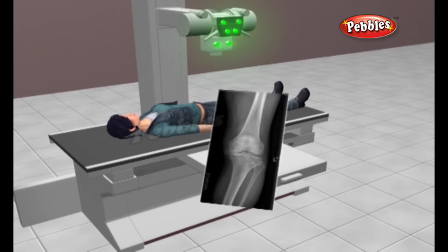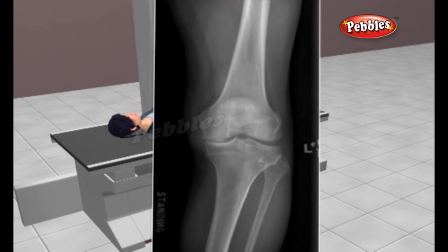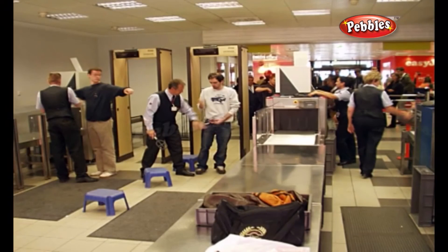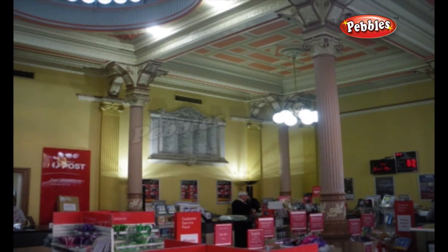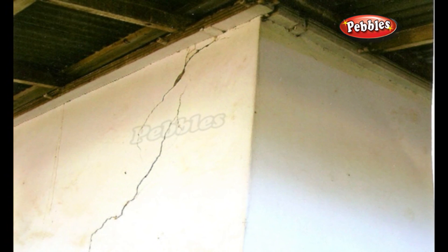X-rays are not just used for imaging the human body for medical purposes. The same basic process is used to scan baggage at many airports, check suspicious packages at a post office or courier depot, and to scan the interior of walls to check for electrical lines and pipes before demolition of the wall.